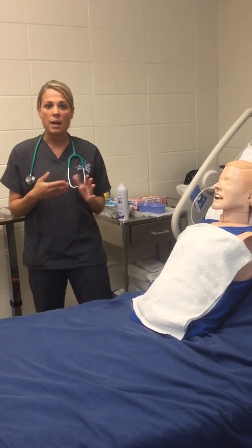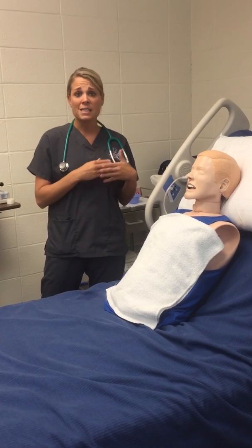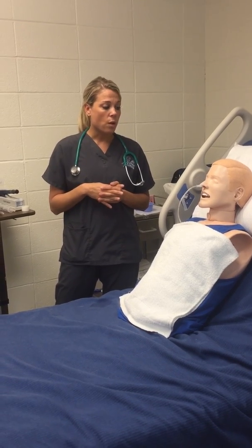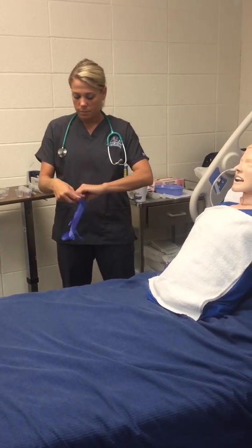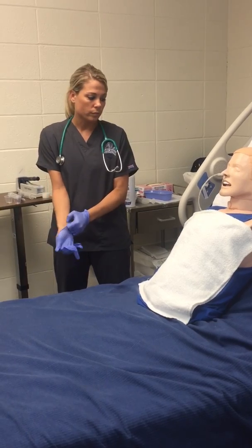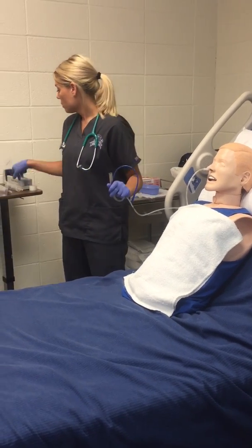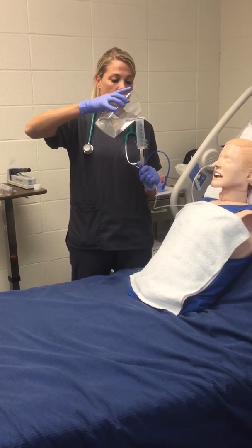And so I'm going to go ahead and identify myself and identify the patient with 2 patient identifiers, provide privacy, hand wash, get the patient in a sitting position, and let him know what we'll be doing, that we're going to be removing the NG tube, and how he can help and cooperate with this. So I will, like I said, wash my hands, put clean gloves on. I would take the tube off of the suction, and we're going to put the piston syringe on, and flush about 10 mils of sterile water into the tube.